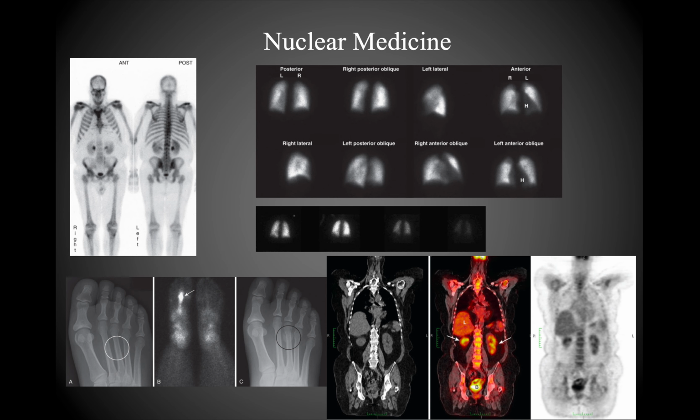So you can see where a bone scan can actually be helpful for identifying these relatively small bone fractures, like a stress fracture or something along those lines. And then on the right-hand side, this is just an image taken a little bit later in the course of healing of this fracture. At this point, you can see where the bone healing has occurred on an X-ray. But again, the initial X-ray was not sensitive enough to be able to pick that up.